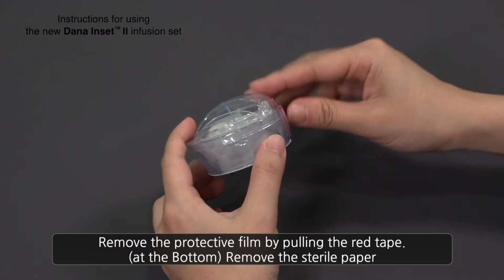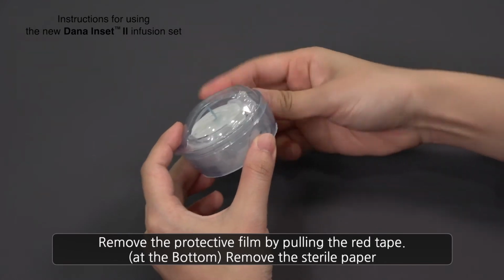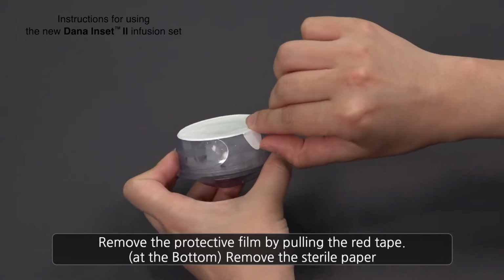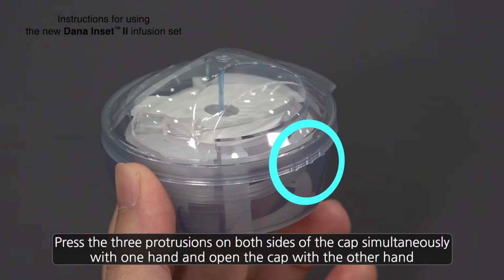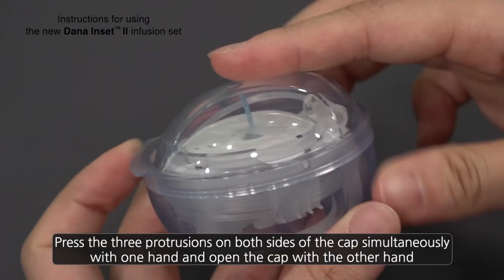Remove the protective film by pulling the red tape. At the bottom, remove the sterile paper. Press the 3 protrusions on each side of the cap simultaneously with one hand, and open the cap with the other hand.